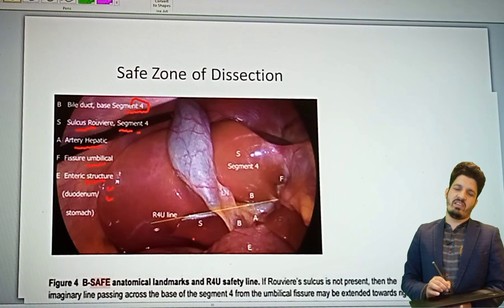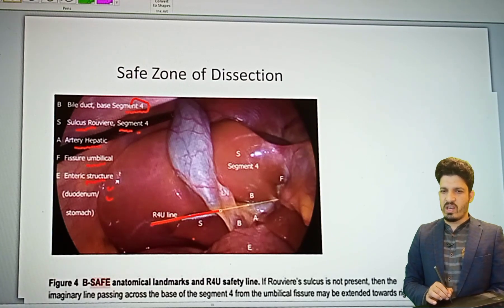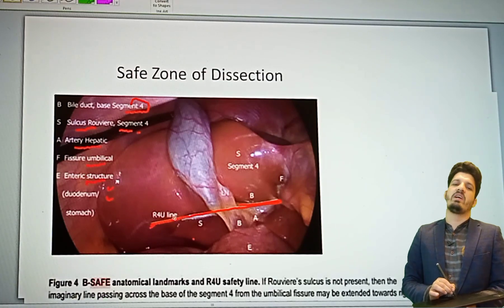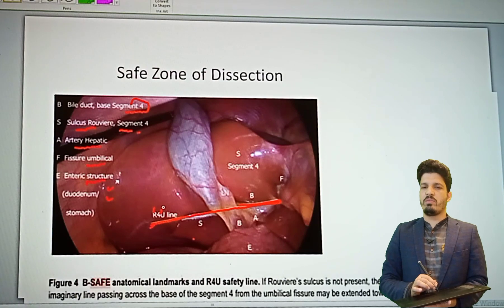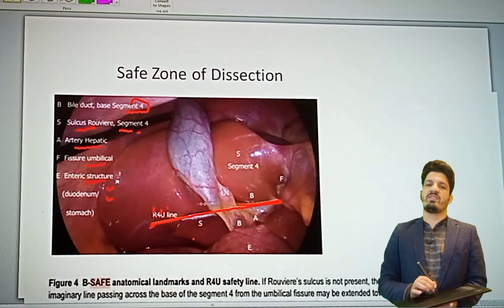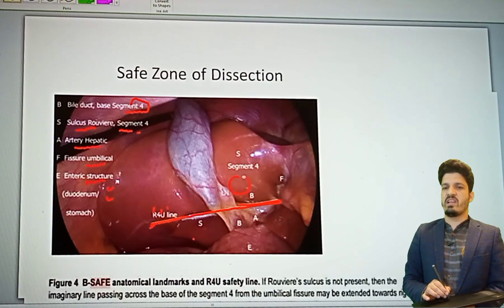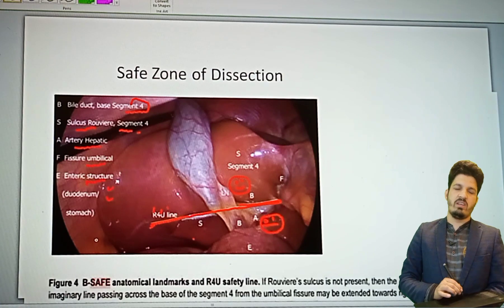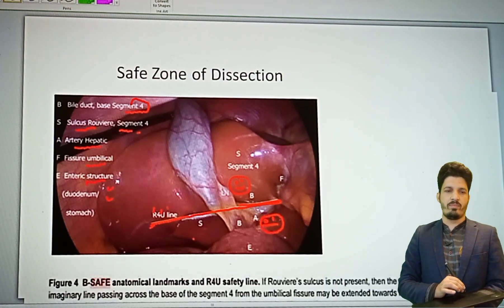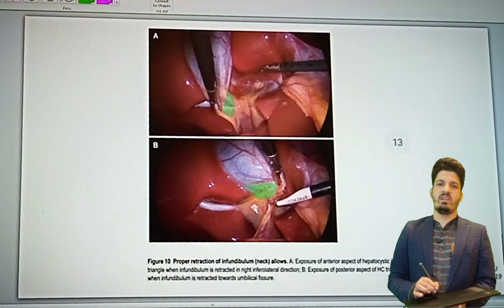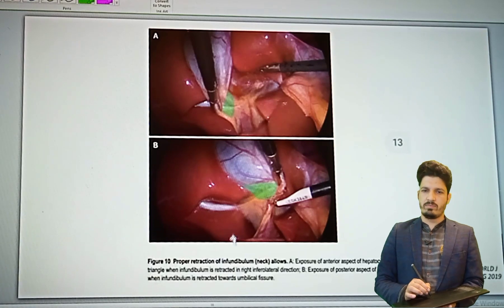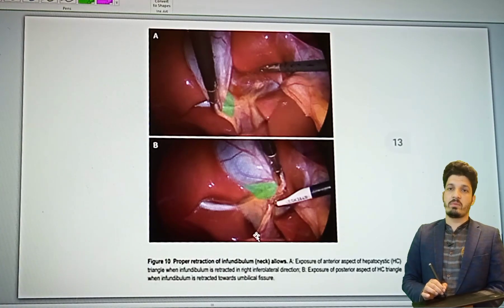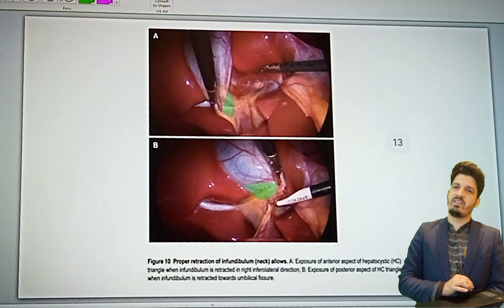We will use the R4U line — an imaginary line where R is Rouviere's sulcus, 4 means the base of segment four of the liver, and U is the umbilical fissure. Any dissection above this imaginary line will be safe; any dissection below this line will be unsafe. Be conscious, be gentle, and dissect above this line to remain safe. Proper retraction of the infundibulum inferolaterally and the gallbladder fundus toward the right shoulder will expose the critical view of safety beautifully.